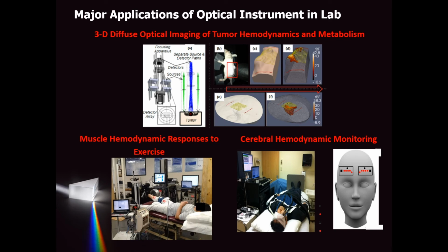Now, after learning the basic concepts of biomedical optical imaging, we are going to introduce some of our lab's activities and some of the main applications of these concepts. The major application of optical instruments in our lab is 3D diffuse optical imaging of tumor hemodynamics and metabolism. The next one is muscle hemodynamic response to exercise.